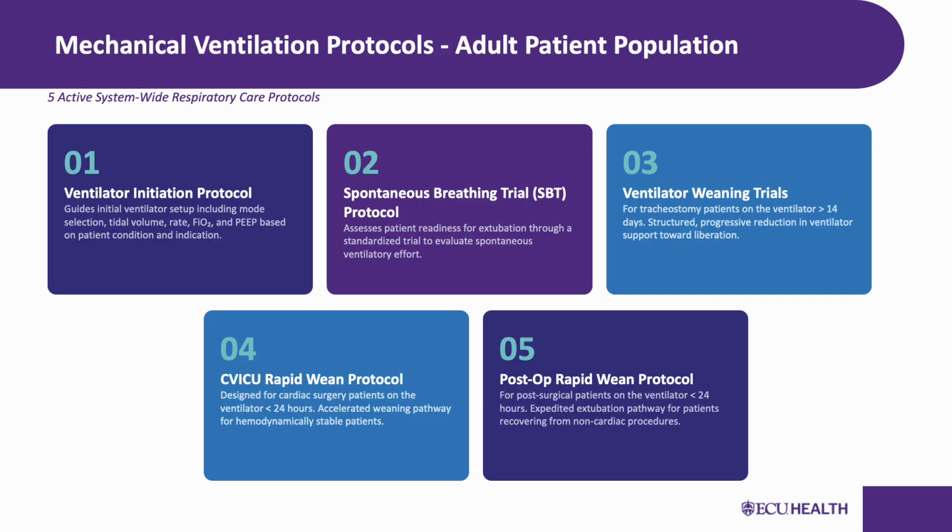Protocol number 1 is our ventilator initiation protocol. This is where everything starts. When a patient is placed on mechanical ventilation, this protocol guides your initial setup, including mode selection, tidal volume, respiratory rate, FiO2, PEEP settings. Think of it as the foundation. If we do not get initiation right, everything downstream becomes harder. We have made updates to ensure our initial settings better align with the lung protective strategies and the PADIS guidelines from the very start.